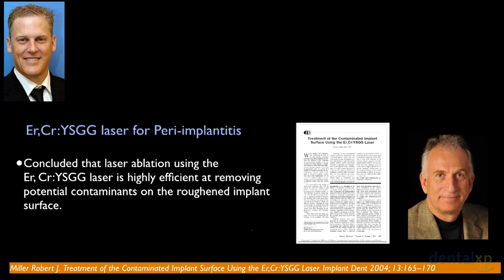Again, the follow-up is short here, so the question remains, what about long-term follow-up? Well, my friend Robert Miller has been using lasers for a long time, much longer than I have. So he has a 10-year case here, where in 2004 he wrote an article on the erbium chromium wavelength, and his conclusion was that it demonstrated no damage to the titanium substrate.